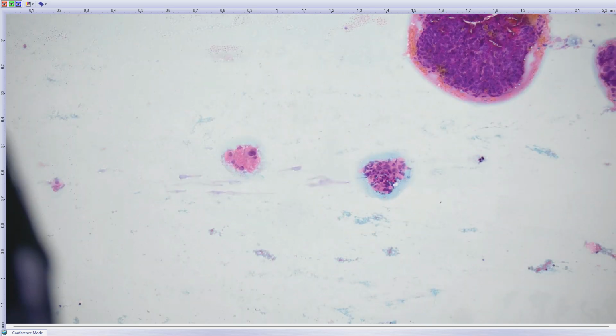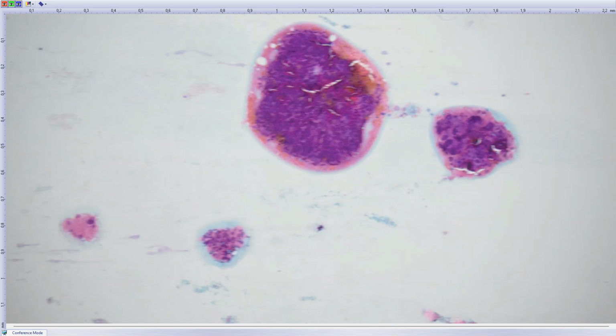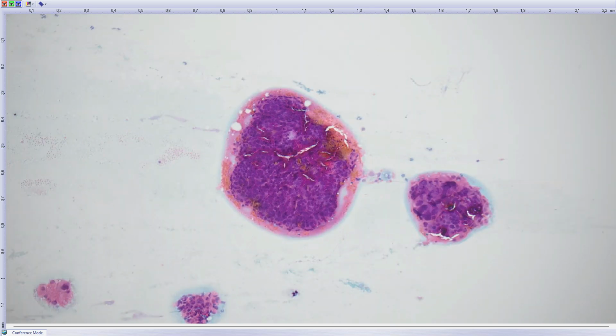We knew that the lady has got something in her gynecological tract. She's after hysterectomy with salpingectomy, and the question was, is this a primary tumor or is this some metastatic lesion? In addition, the lady had colorectal carcinoma in her clinical history. So our diagnosis was malignant, probably metastatic, and please check the records and compare with previous histology, because this may be a metastasis of high-grade serous carcinoma, I guess.